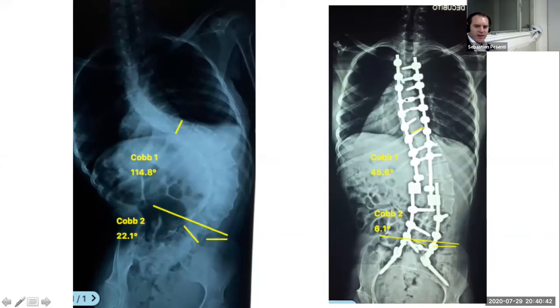Because that's something that sometimes we use in our patients, like when we feel that we need too much force in order to put the rods in the hooks or in the screws. You can tension your bends a little bit earlier than you would usually, and it helps you to lower the rod. I don't know if I make myself clear. Like it helps you to correct the spine, and you need less force and less constraints on the screws to insert the rod. Can be useful. But this one is very impressive. It's quite challenging to perform surgeries with such deformities.